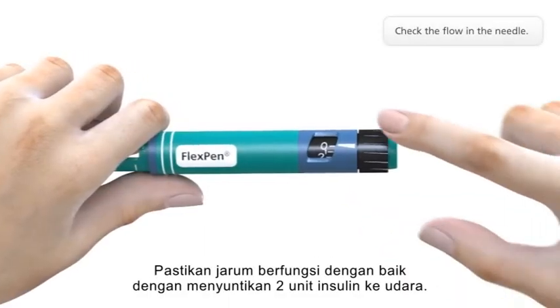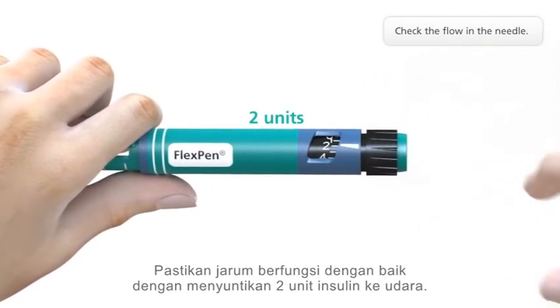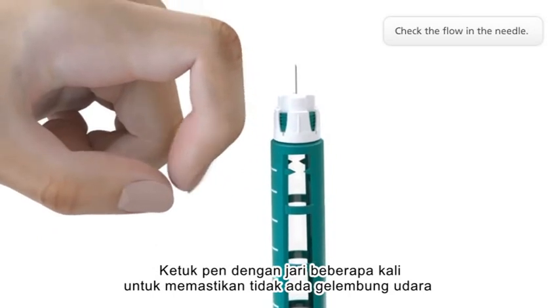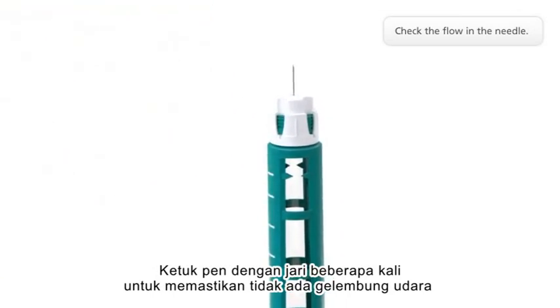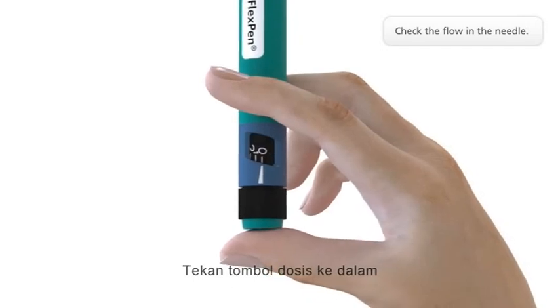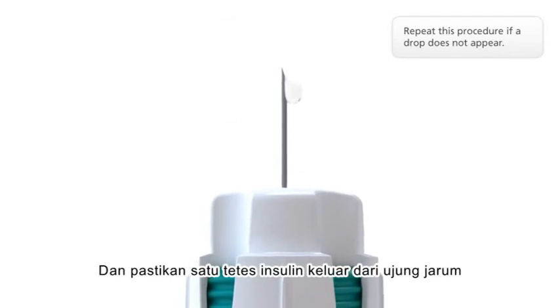Check the flow in the needle with an air shot of two units. Tap the pen gently a few times to make any air bubbles collect at the top. Press the push button all the way in and make sure that a drop appears.